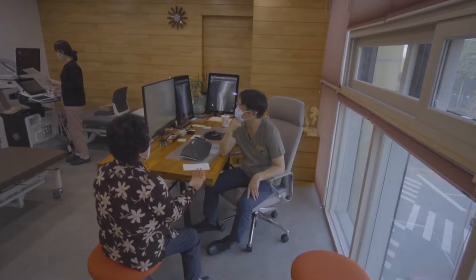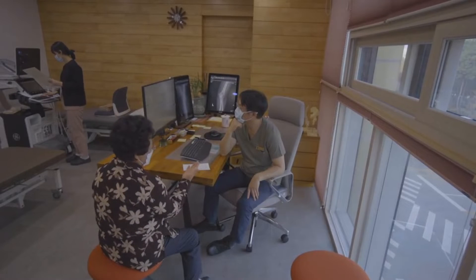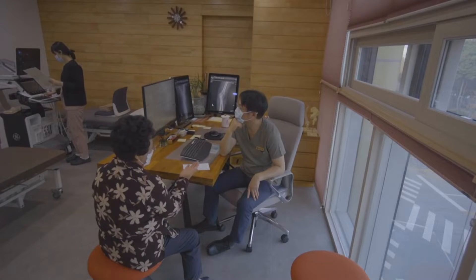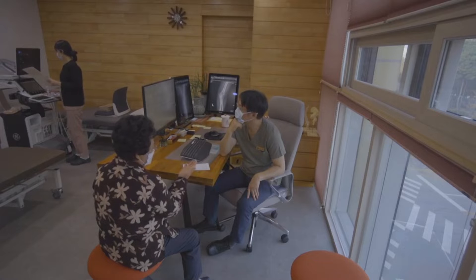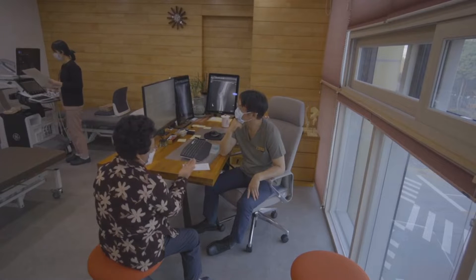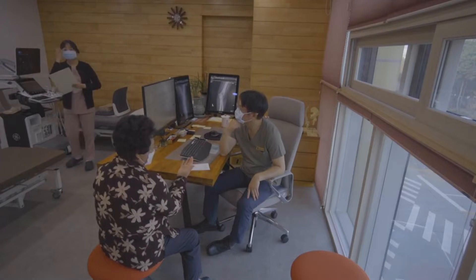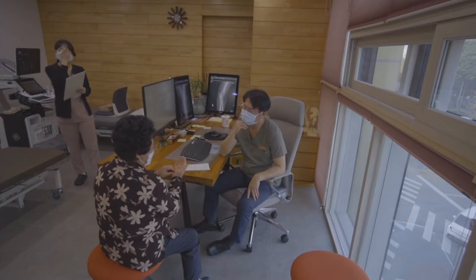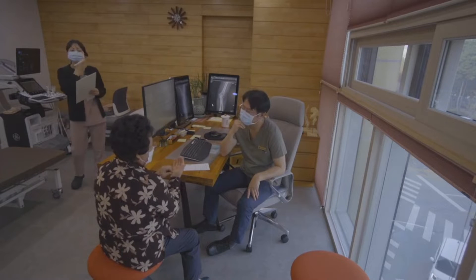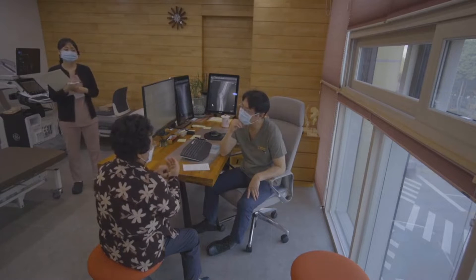Welcome back. I am Dr. Lee's AI Speaking Assistant in Practical Pain Management. Streaming in the ultrasound room, I will show you some basic ultrasound practical anatomies and ultrasound-guided interventional procedures.